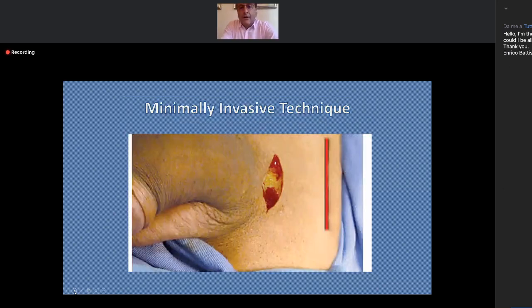Okay. I want to speak about the infrapubic approach, but in particular, I want to speak about the minimal invasive technique. It is the technique codified almost 12 years ago by Paul Perito, one of the most important surgeons of penile prosthesis implant all around the world, and one of the largest implanters in the United States.